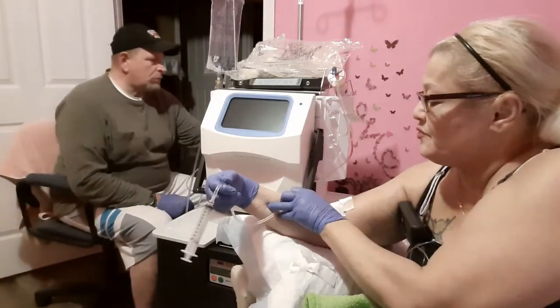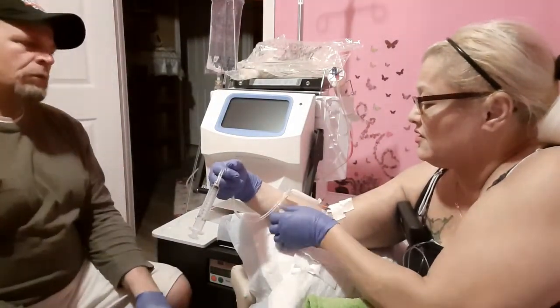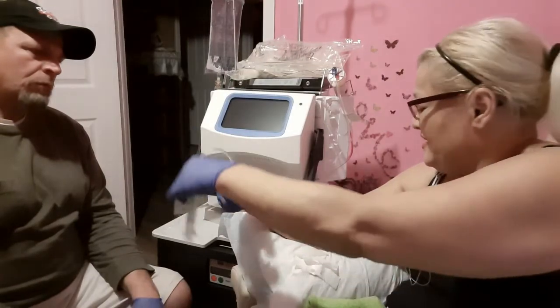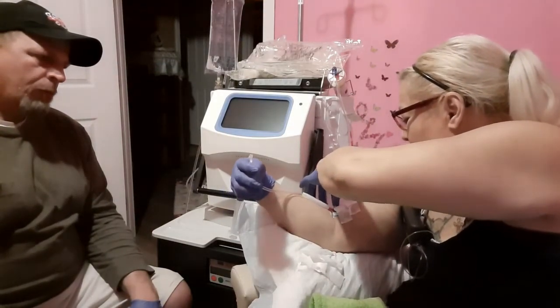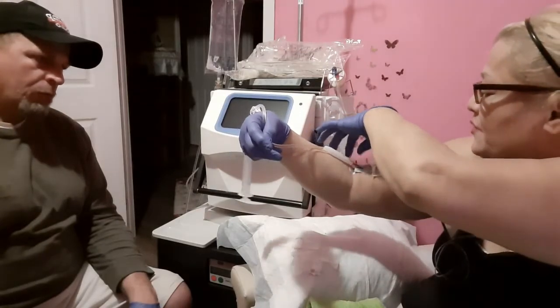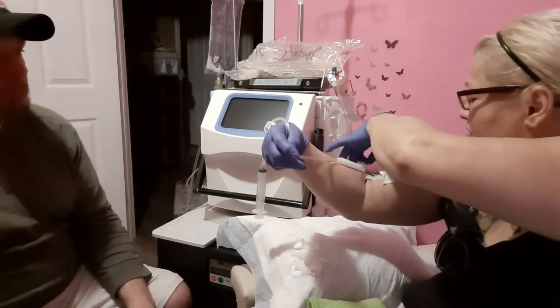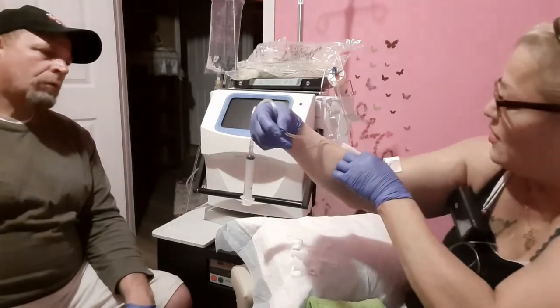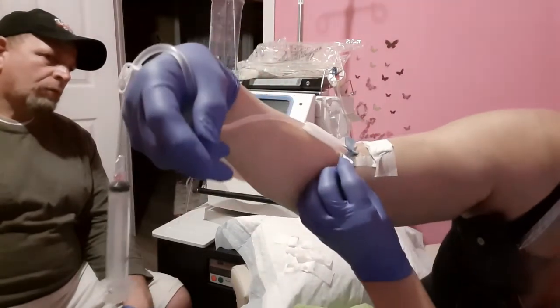So now we're going to remove the arterial, so Hubby is going to come around and get ready to grab this syringe and dispose of it in the Sharps. I call it Sharpie, it's Sharps. Alright. Okay, so let's go ahead and remove the top. And we're going to remove our wings. Just grab it. Sometimes it's, there we go. And then just hold it and pull. Okay, there's one. Always from the bottom and up towards you. Always do that. Okay. See? I'm pulling.